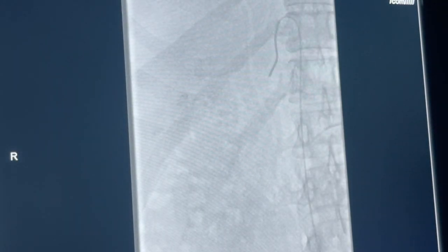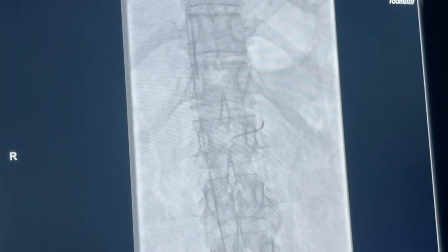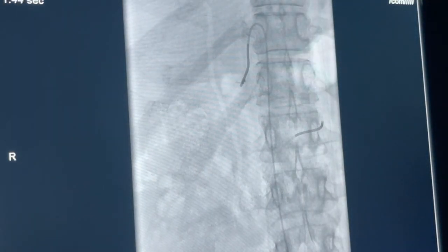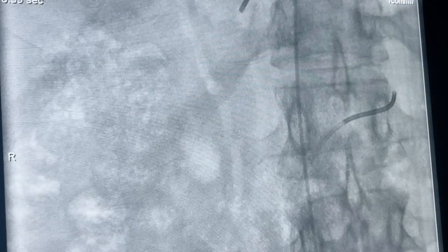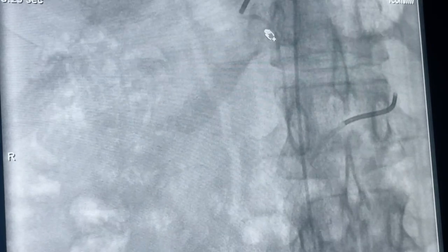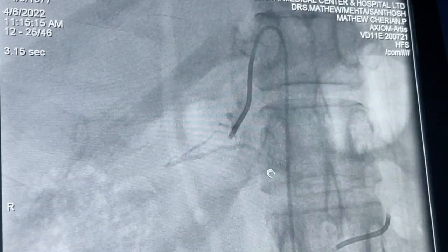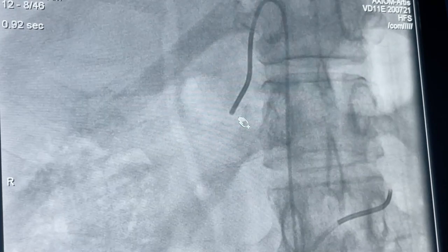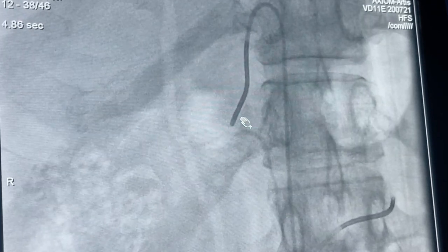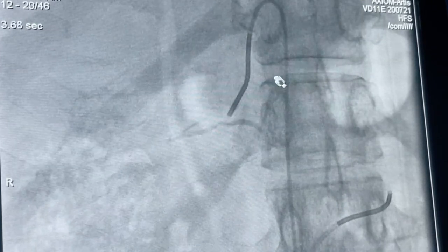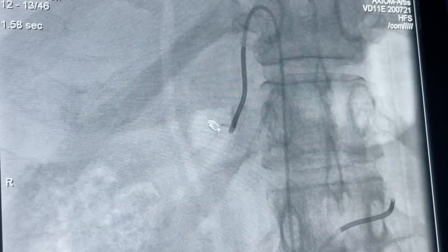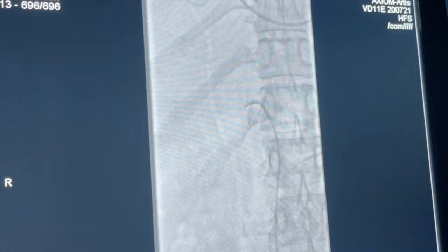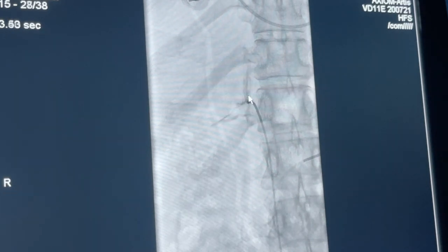The reason for showing all these runs is to illustrate that it may take time and you should not be concerned. Here you can actually see the adrenal vein with the draining vein coming back. The problem encountered was that the Sim 1 was going so deep it yielded no aspirate. Knowing the landmark — midpoint of D12 — he switches to a Cobra catheter and this time the adrenal vein is confirmed and an aspirate is successfully obtained.